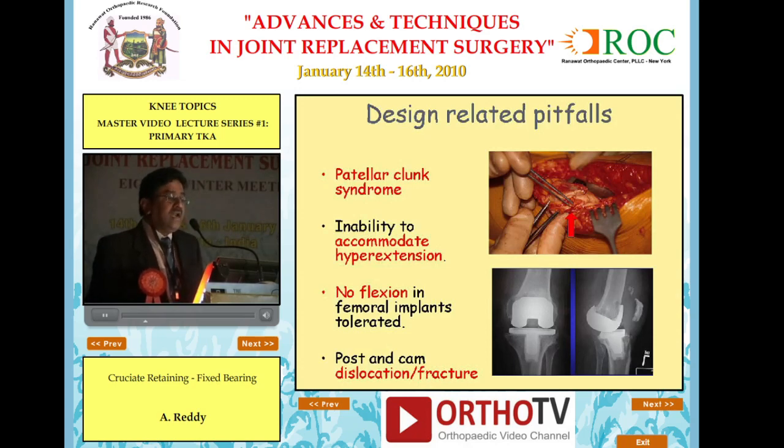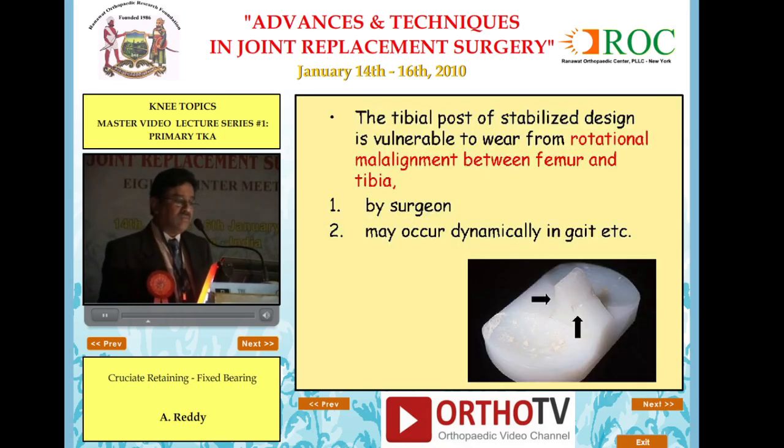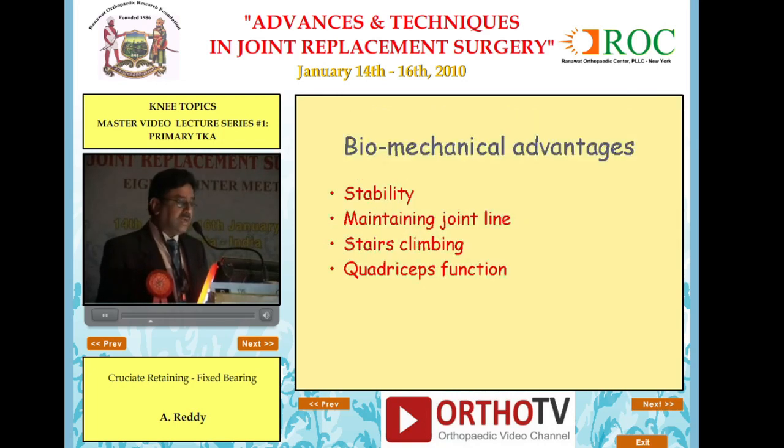Design-related pitfalls of the posterior stabilizing are patellar clunk syndrome, which is exclusively for the posterior stabilizing knee, inability to accommodate hyperextension, no flexion in a femoral implant is tolerated, and post and cam dislocation or fracture. These are some of the inherent PS design problems. The tibial post of the stabilized design is vulnerable to wear from rotational malalignment between femur and tibia, one by the surgeon, and it may occur dynamically in gait, etc.